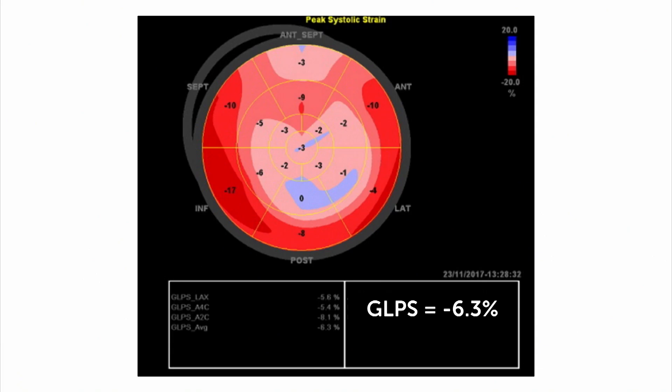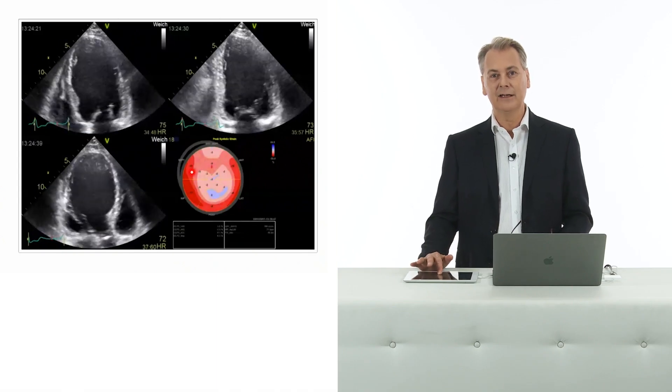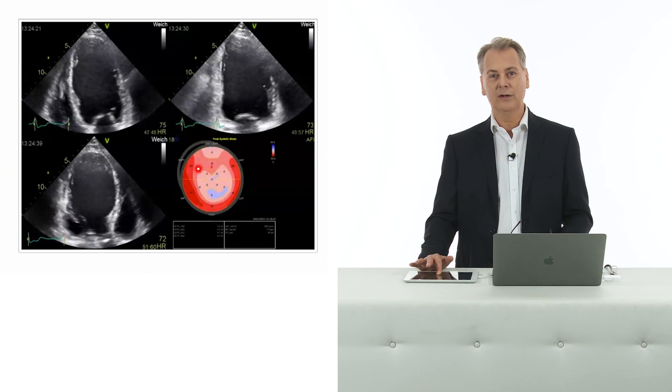Can we pick up these regional differences? Well, yes we can. Here is the bullseye display, and exactly what we see with our eye and with the coronary angiogram, we can confirm here: there is a reduction in strain specifically at the apex and the anterior wall as well as the septum.